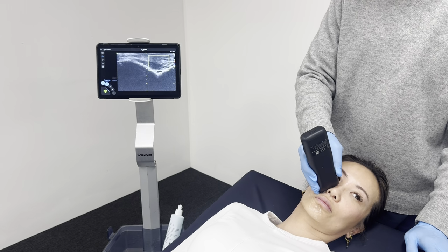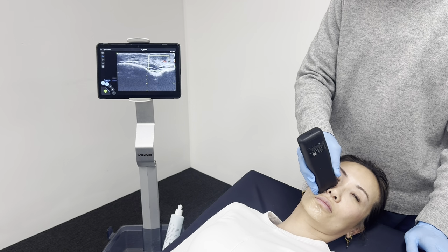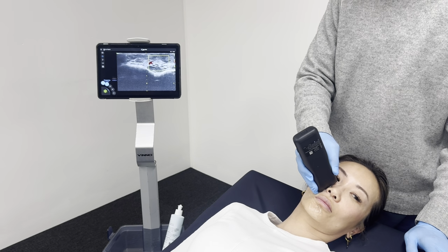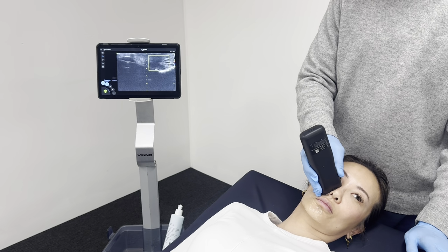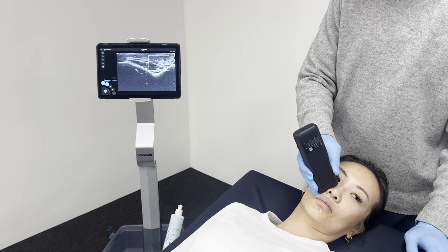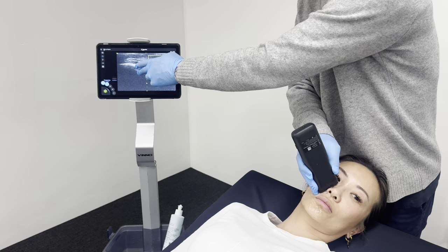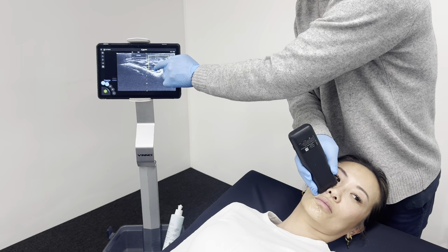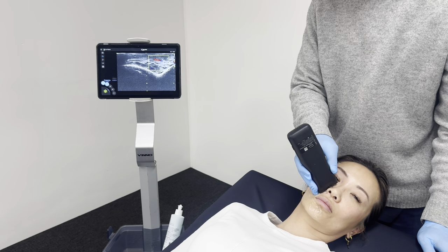And if we're not seeing it, you can just tilt the probe, move the probe back and forth, and you should find somewhere in this area, there it is, that angular artery. So sitting well above the bone. And just lateral there. I'll just turn up that colour gain again just to see if I can see that a bit more clearly. Yeah, that's better. So I can see that sitting quite superficial there.